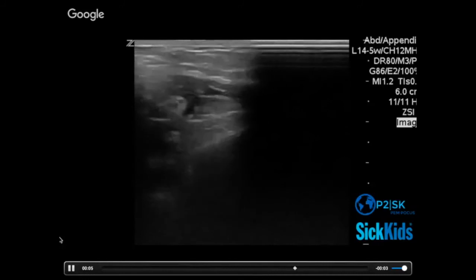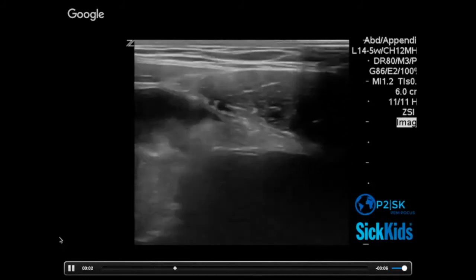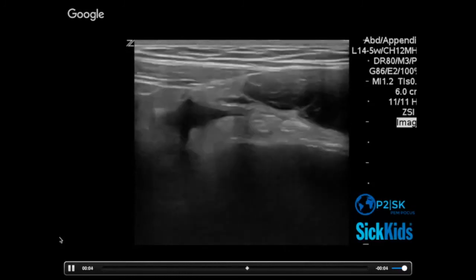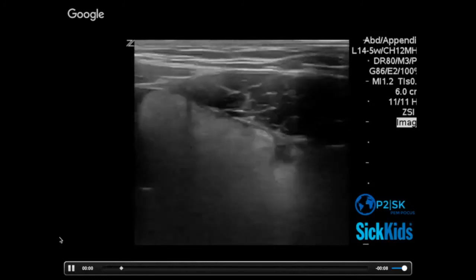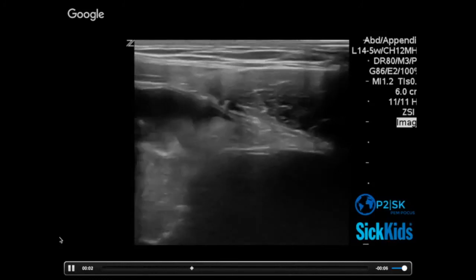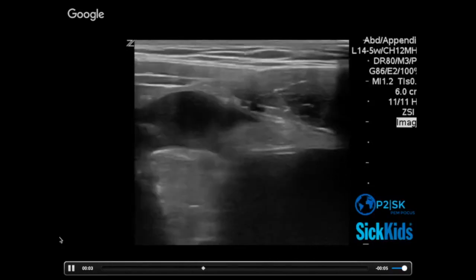So the fact that you guys can look at this and say, that's a high risk exam, well, how does that perform in terms of comparing someone doing that to not using ultrasound at all as a point of care provider? We don't really know yet. Those of us in the field believe that it makes you better, and we've got to prove it. We're at the beginning of proving some of these things, and I'll show you some of that data.